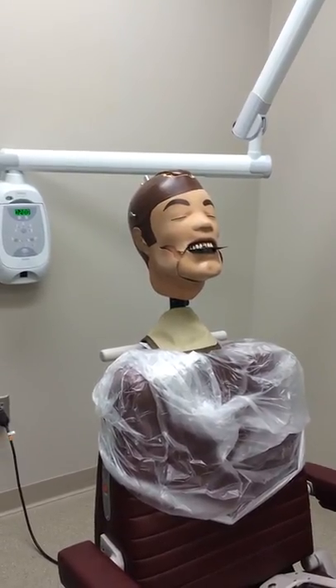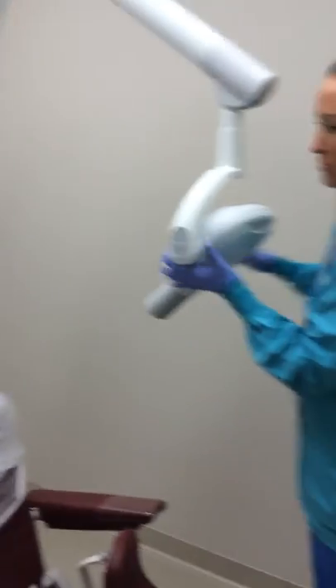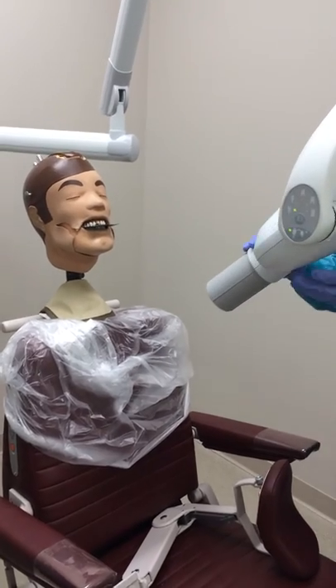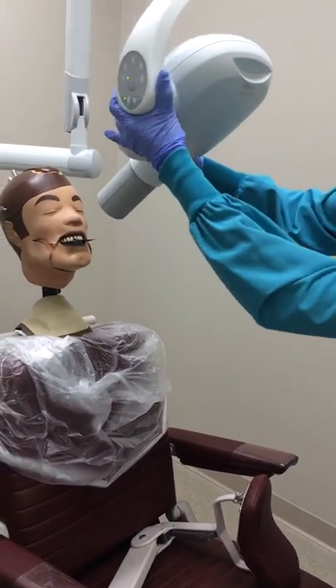Angle the central ray vertically at 45 to 60 degrees. The horizontal angle should be 0 degrees. Center the ray over the tip of the patient's nose.